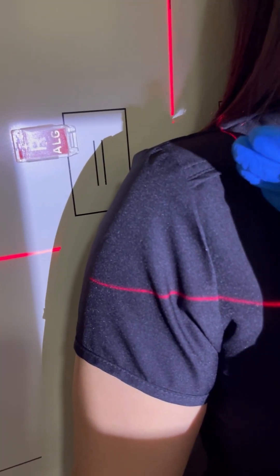For girls, I would have them take their bra strap down so it's not going to be in the way, so that the adjusters won't be in the way.